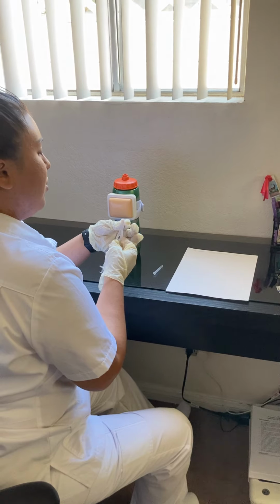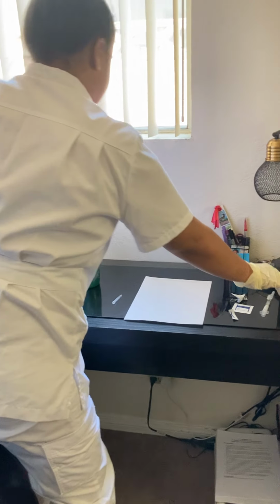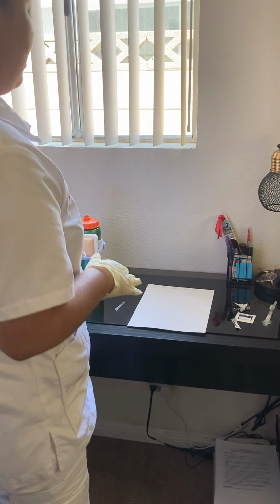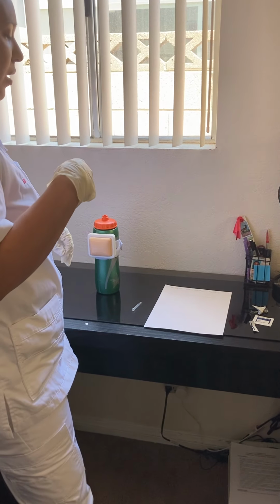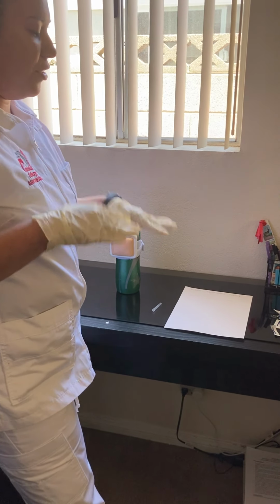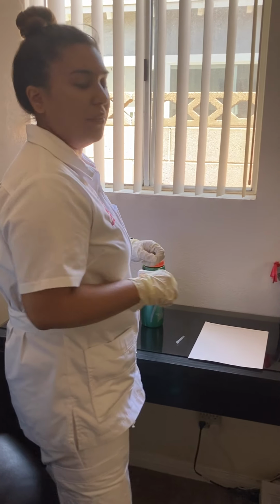I'm going to engage the safety, discard the needle in the sharps container, and I'm going to go ahead and make the patient comfortable. So I would put the gown back up, anything to make the patient comfortable, and then discard any trash, and lastly document the medication given accurately.